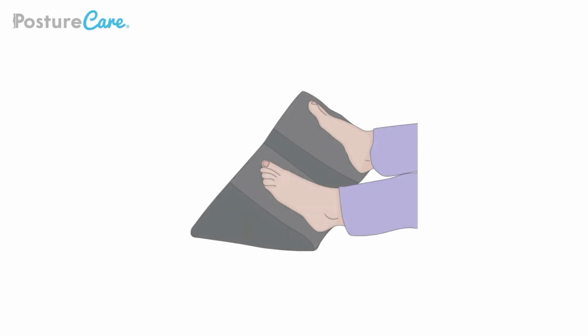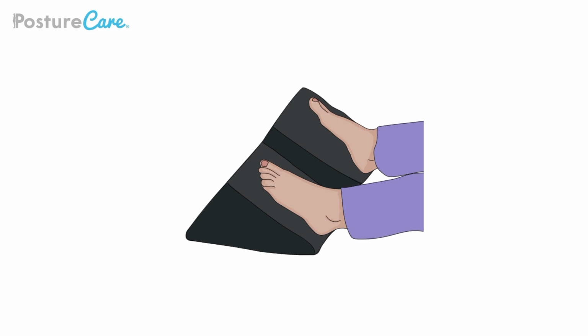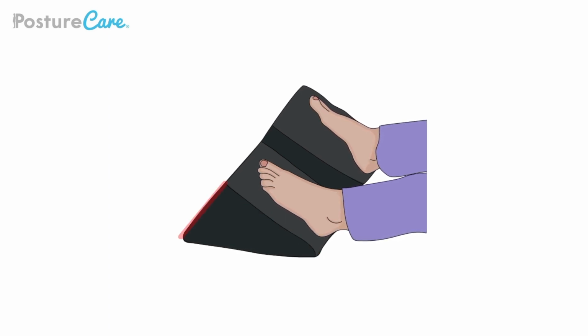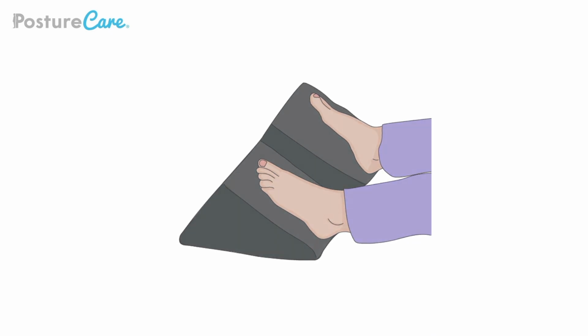Supporting the feet. Double edge wedge. The feet are supported by a double edge wedge. The support discourages the feet from falling into a pointed position and they provide a gentle stretch on the calf muscles. The double edge wedge is specifically designed to offer two different angles which provide a greater or lesser stretch on the calf muscles. Remember as well that supporting feet should limit your client sliding down the bed, and feedback from the cushions should also aid the swallowing function where appropriate.